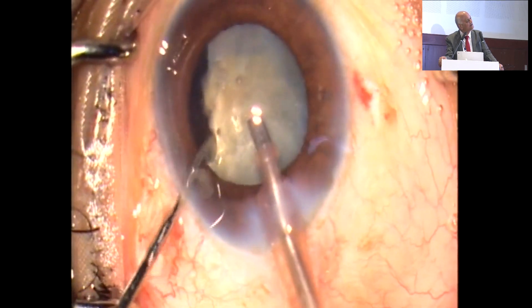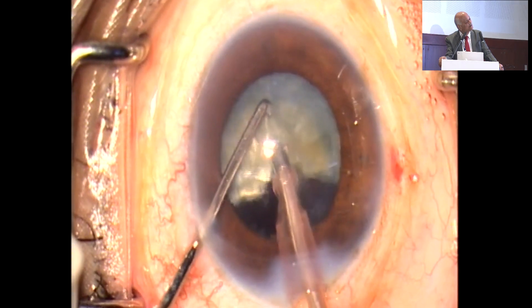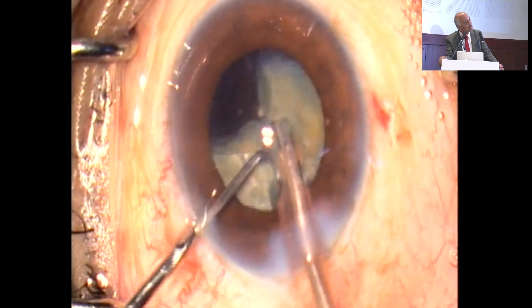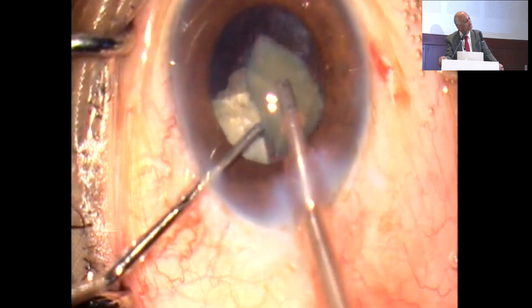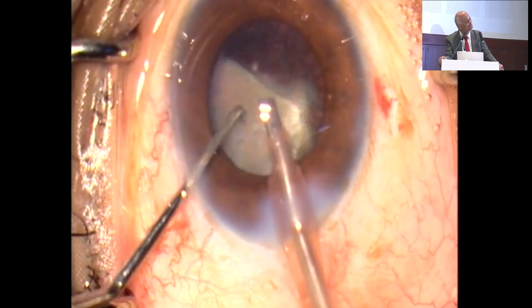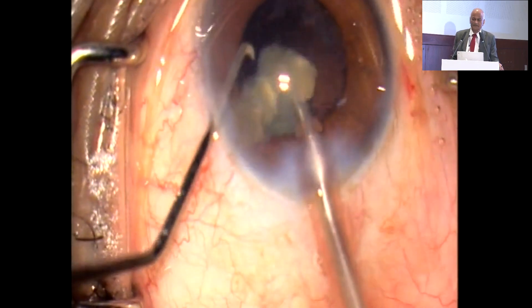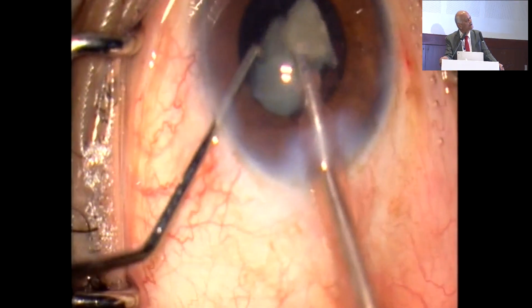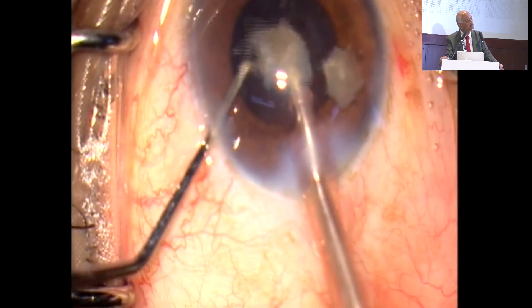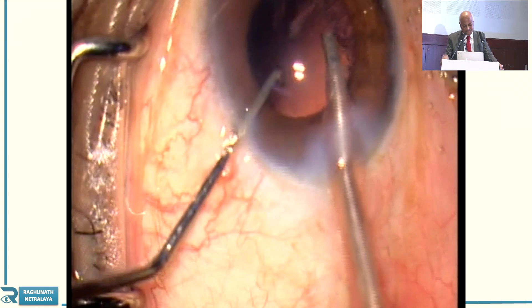See here — I am rotating, and once I rotate you can see how the piece is separated. Because once your tip is inside the substance, you can definitely chop the piece. Gradually the last piece is there — you must go very carefully for the last piece. You stabilize the piece with the tip of the faco, and then the chopper separates it. You can do four pieces, six pieces, or two pieces — debulk it and then go for the other two pieces. That depends on your convenience.